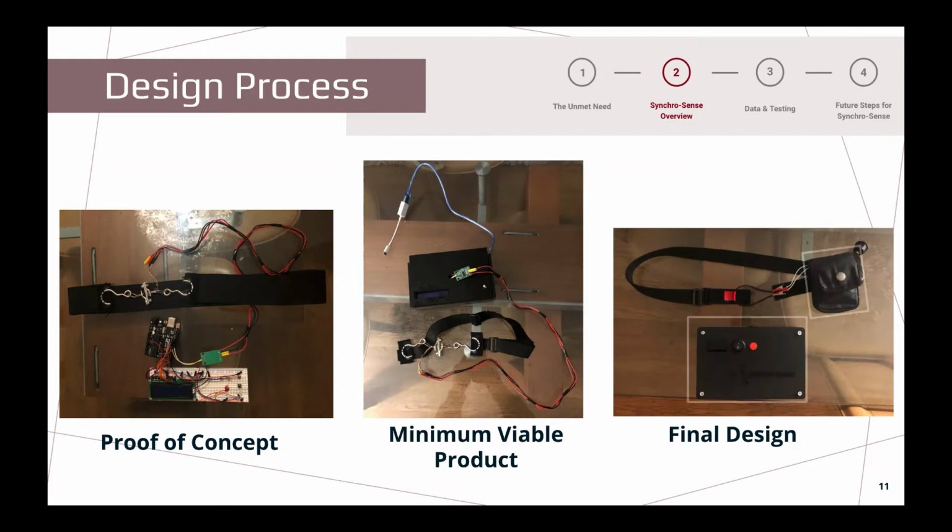We also 3D printed a new, more aesthetically streamlined enclosure and included a pouch to enclose the circuitry of the sensor. To further reduce image obstruction by the sensor, we replaced the metal sensor with the more durable, conductive rubber sensor so that it will not show up in the image. To allow our device to be battery-powered, we also installed power switches on both components of our device. Finally, we replaced the push button and LCD screen with higher quality components.